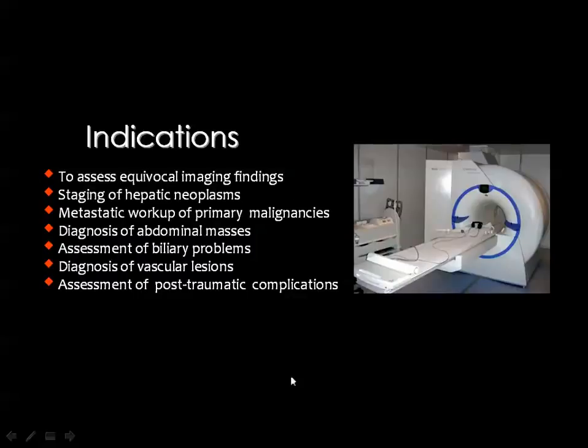The usual scenario is a patient who is complaining of abdominal pain and is subjected to an ultrasound examination, for example, and the report of the ultrasound was not that conclusive and recommended to be followed by a CT scan of the abdomen. There are many situations like a barium study, which was not so conclusive, IVP, and so many other investigations, but commonly the ultrasound.